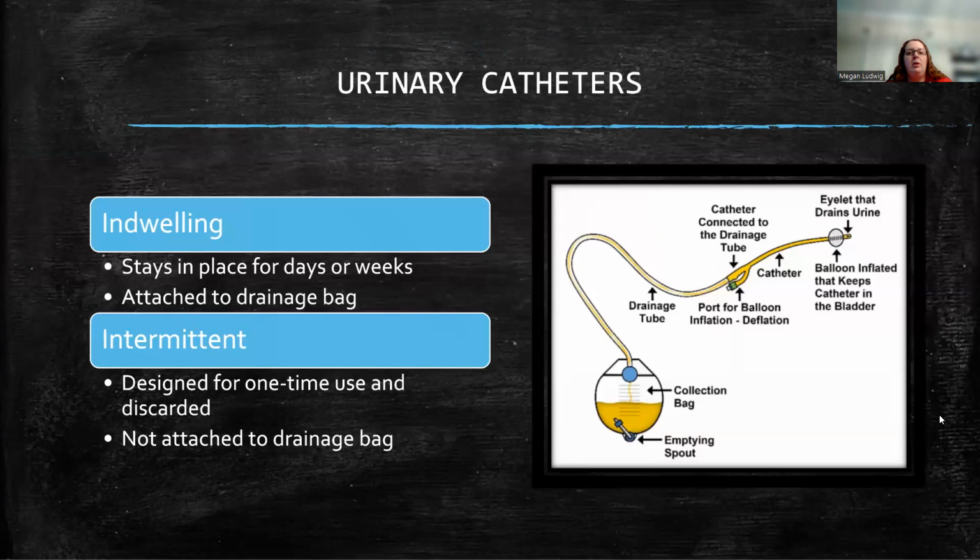Okay, our next supply are urinary catheters. So we do have some dealings with catheters, especially if you're going to be an OB/GYN or a cysto room. Very often they're going to be working with catheters, maybe more so than others. Circulators can put in catheters, and depending on your facility, are often trained to put in Foley catheters as well. Again, it depends on your facility if that's okay with them. It is something that's in your surg tech book that we can be trained to do. So if you've had the proper training, you should be able to do it.